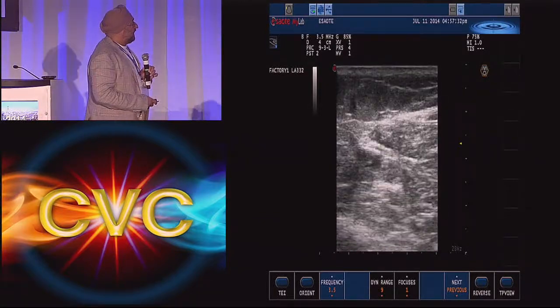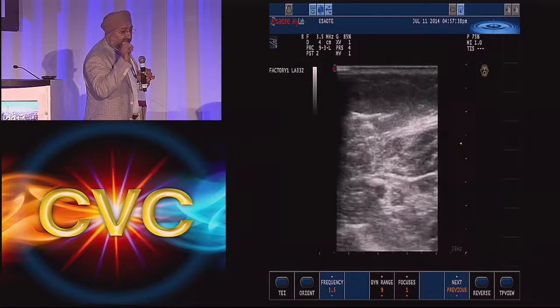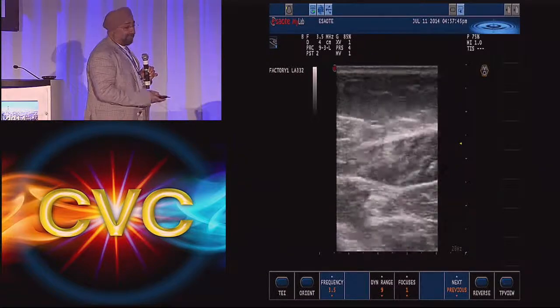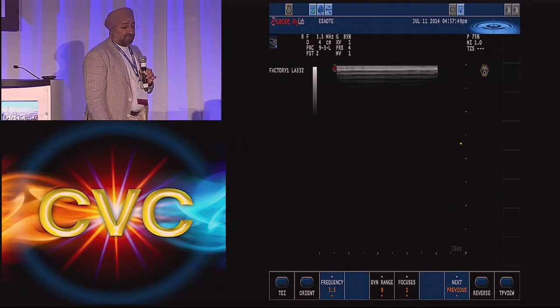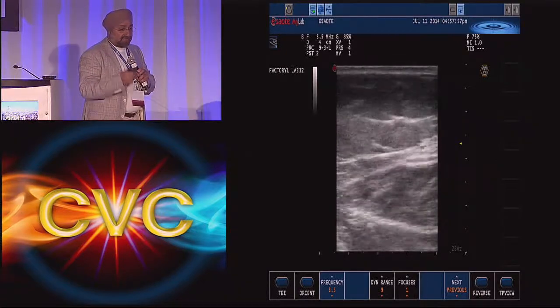Depends. It's somewhere it's not FDA approved, but you can put a short laser fiber through a needle and just zap that thing, three seconds. Companies that have tried to market it for perforators have gotten into trouble with the FDA. But what you do is you get a needle, puncture into it, get the fiber just outside, give a little tumescent local, and zap it.